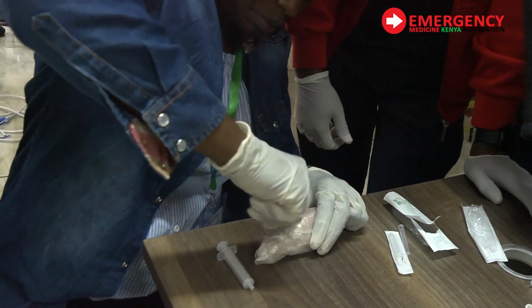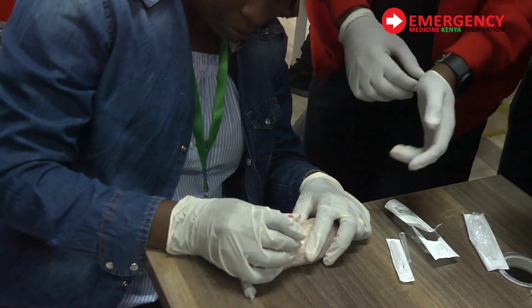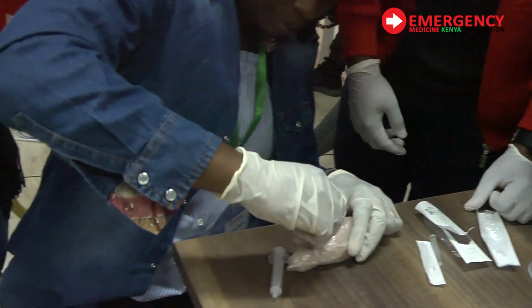It has gone right to the meat, yeah. So you locate the flat surface of the bone. Do it here.